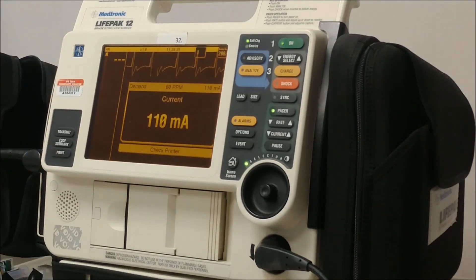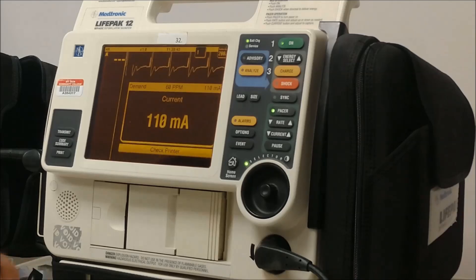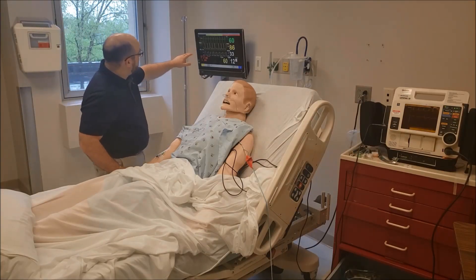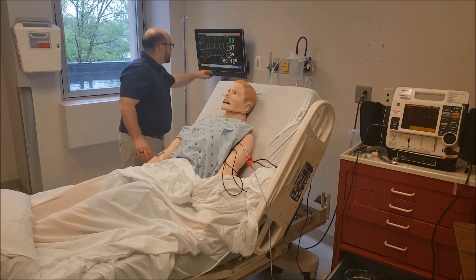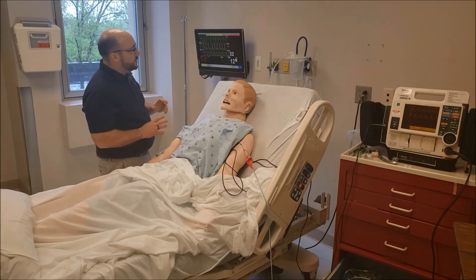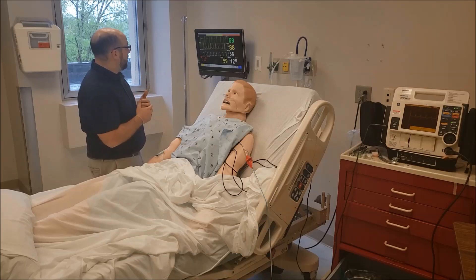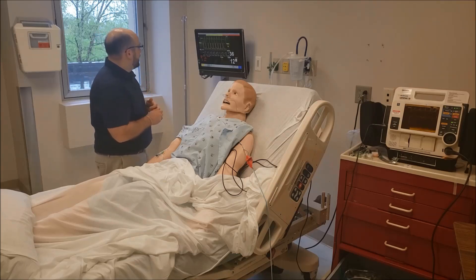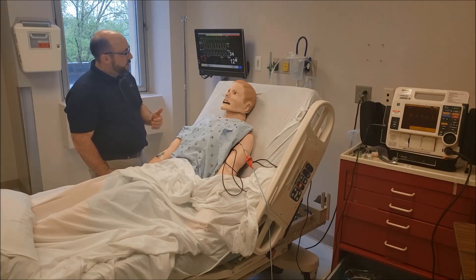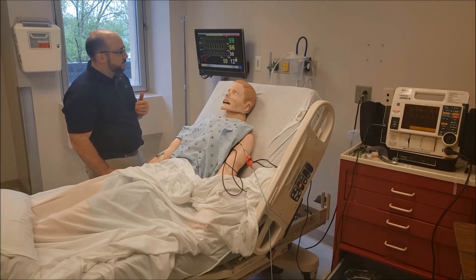With a pacer rate of 60, I'm going to reassess my patient. We see he has a heart rate of 60. I'm going to retake his blood pressure. The saturation is still low, so we're probably going to change the oxygen device — move him up to a non-rebreather. The pace rate is at 60, it's perfusing well. We're looking for a blood pressure at this point.